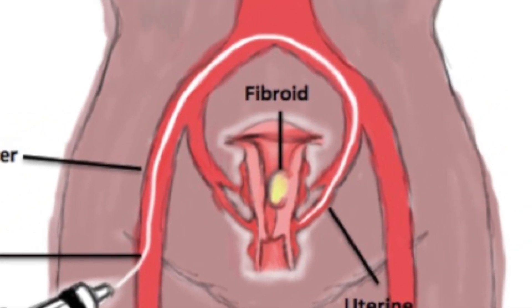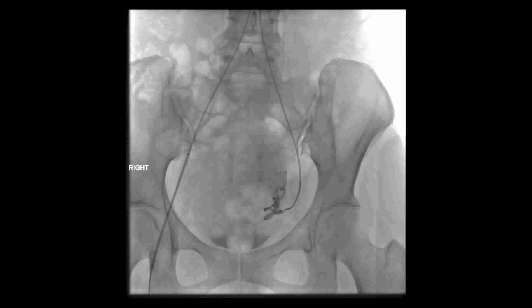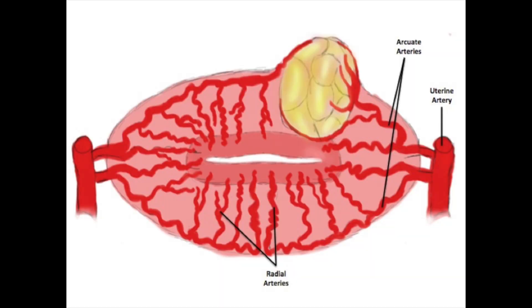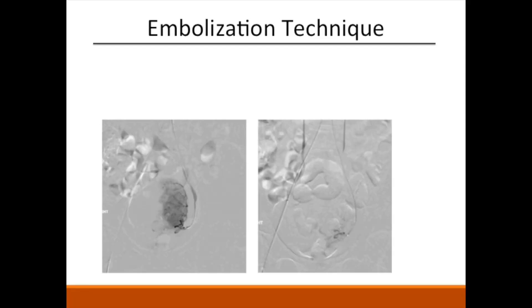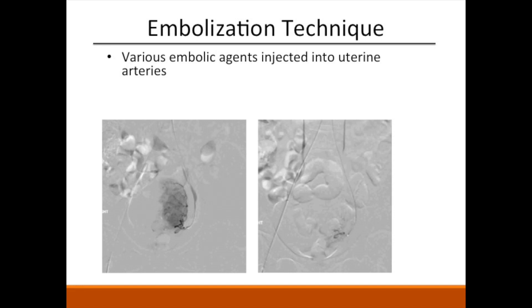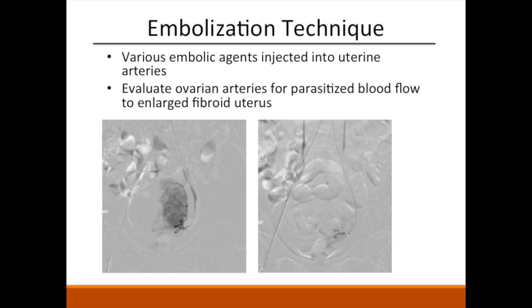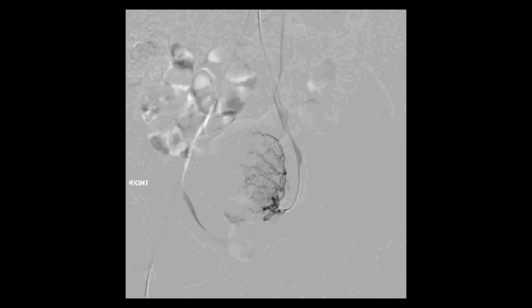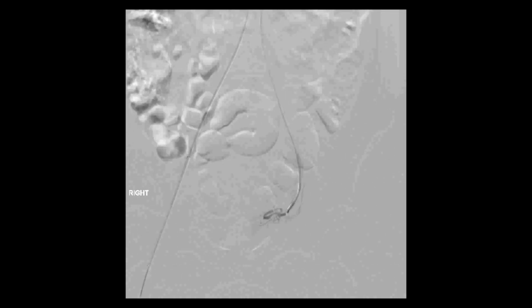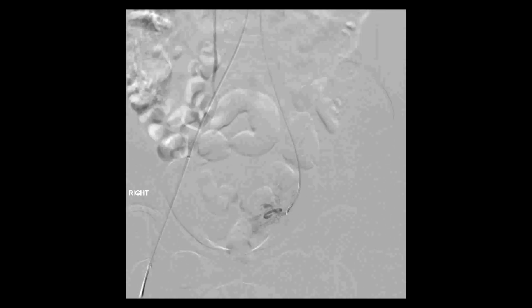Under fluoroscopic guidance, the catheter is guided through the artery to the uterus and advanced to the site of the fibroids. With angiography, the uterine artery origin is identified and normal versus variant anatomy is confirmed. Due to the tortuous nature of the uterine artery, atraumatic catheter advancement is essential to prevent vessel spasm. Once the fibroids are located, various embolic agents are injected. The ovarian arteries are evaluated for any parasitized blood flow to the enlarged fibroid uterus. A series of angiographic images are obtained pre- and post-embolization to ensure proper occlusion of blood flow to the fibroids.